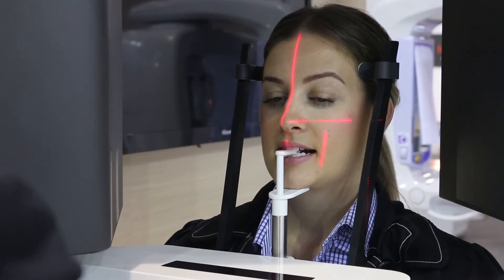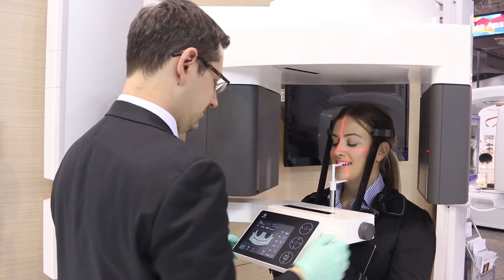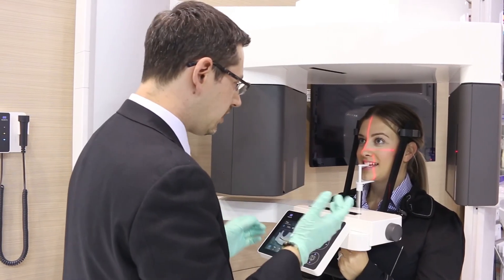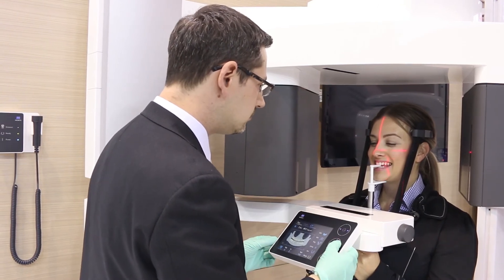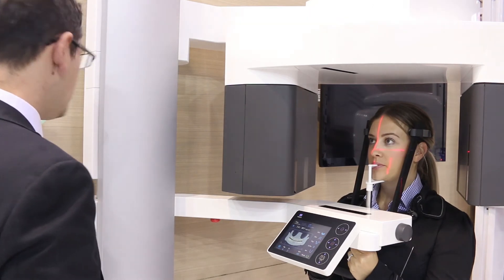Now close the temple stabilizers to achieve a stable patient restraint. Ask the patient to smile so the operator can adjust the coronal laser beam to the distal of the canine tooth.